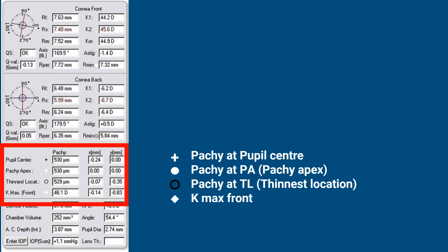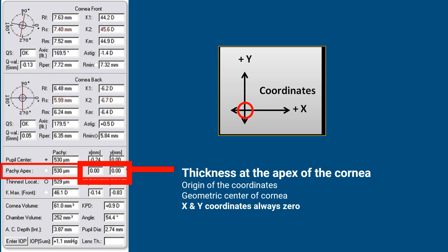In the third set there are four values. The plus sign is the pachymetry at the pupil center. The white circle is pachymetry at the Pachyapix. The black circle is the pachymetry at the thinnest location. And the cross-rectangular marker is Kmax on the front surface. The Pachyapix is the geometrical center of the cornea where the origin of the coordinates starts — X is 0 and Y is 0 there — and all other values are measured relative to it.